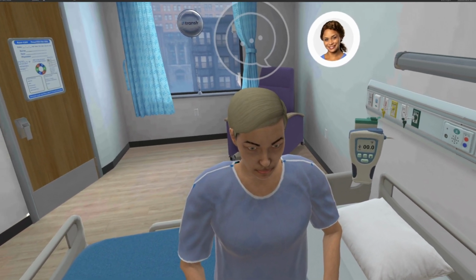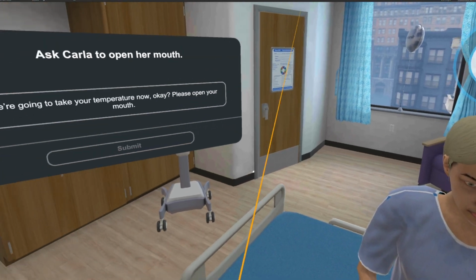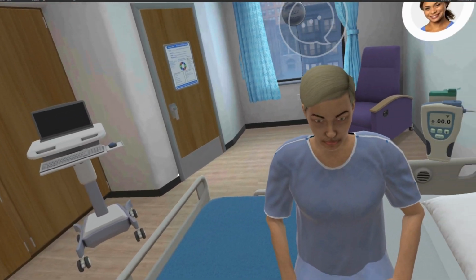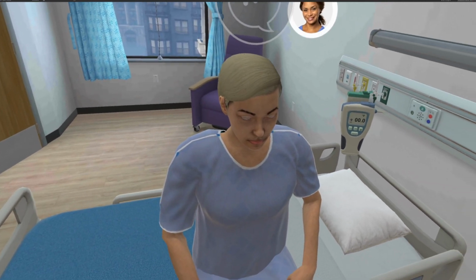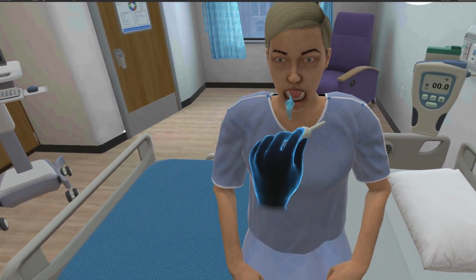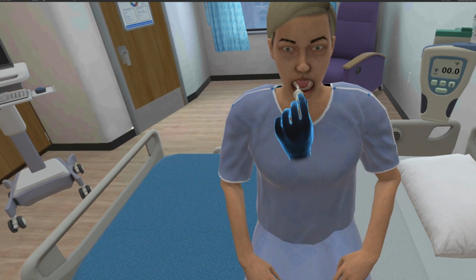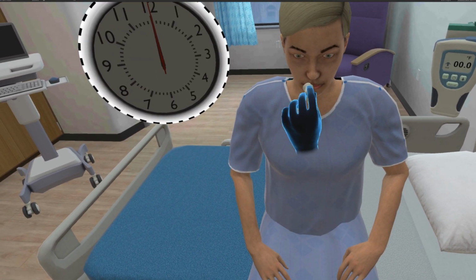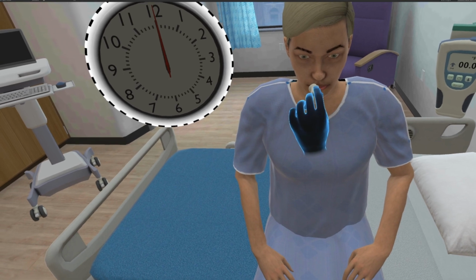Ask Carla to open her mouth. We're going to take your temperature now, okay? Please open your mouth. Gently place the probe in the back of her mouth, under her tongue. Hold the probe in place. The thermometer will beep in 10 to 15 seconds when the reading is complete.